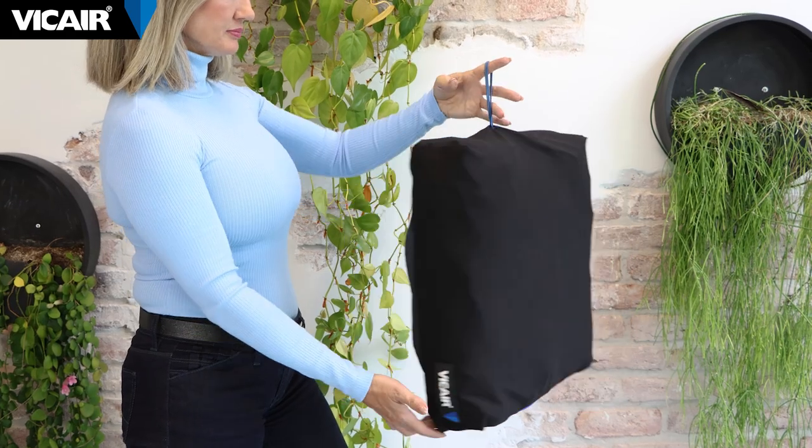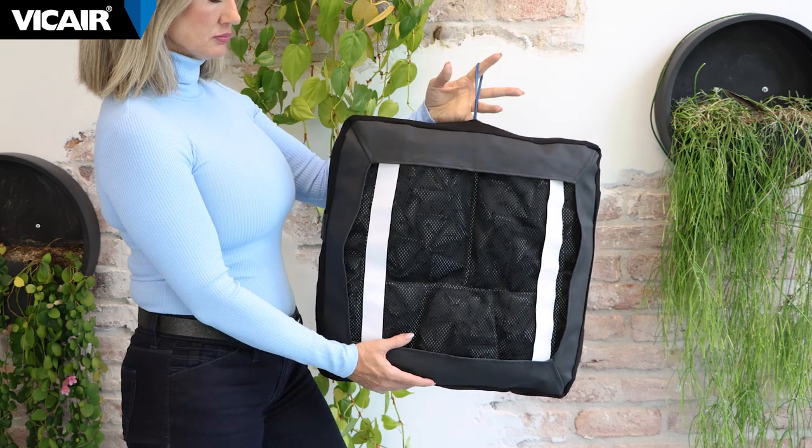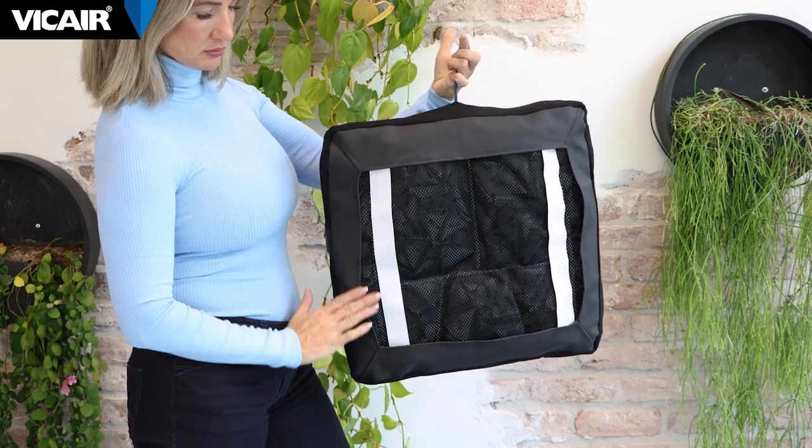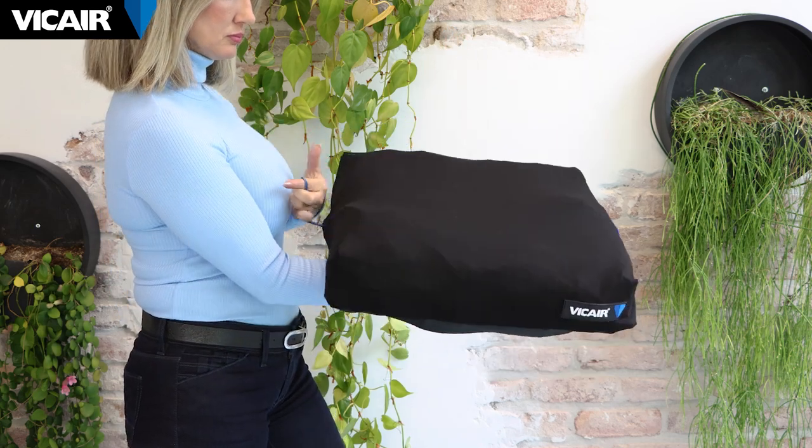We offer several covers with our cushions. This is the vCare O2 top cover, our standard cover. The vCare O2 top cover has a breathable top side and an open bottom to enhance microclimate control. On the bottom, there is an anti-slip strip to help prevent sliding of the cushion.